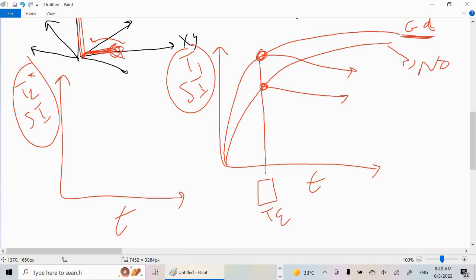Well, I need a fast sequence. I need a fast sequence because this topic will analyze this issue, and you get a fast sequence because you are talking in seconds, and it maximizes the difference, which is shown by the gradient echo. There is a specific type of gradient echo called echoplanar imaging, which we will talk about a little. We established the relationship of the T1 weighted image with T2 star weighted image.